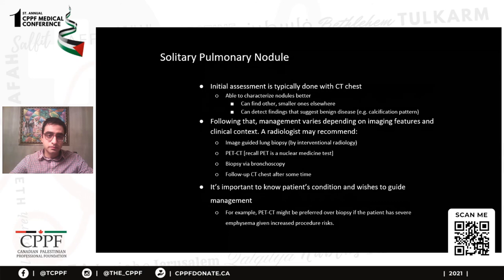So typically, when we find a lung nodule, the initial assessment is done with a CT. As soon as we identify a lung nodule, we request a CT. It's able to characterize the nodules better. It can find other nodules elsewhere, and it can detect findings that suggest benign disease, for example, the pattern of calcification. X-rays are not sensitive for lung nodules, and they often miss lung nodules. So if that's the suspicion, X-ray is really not the right test.